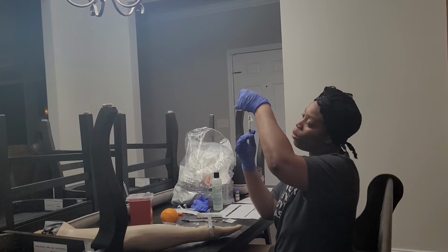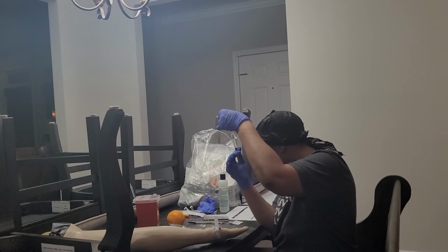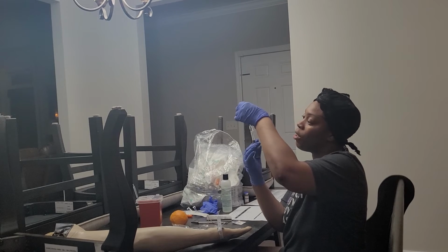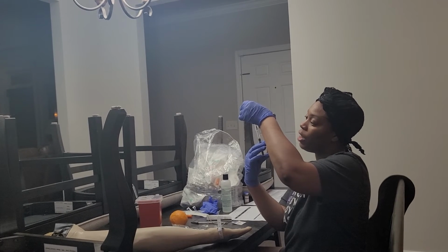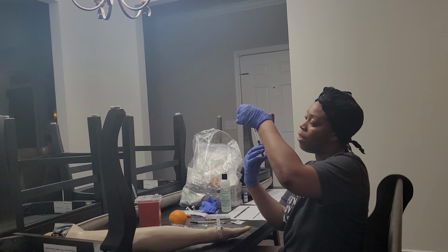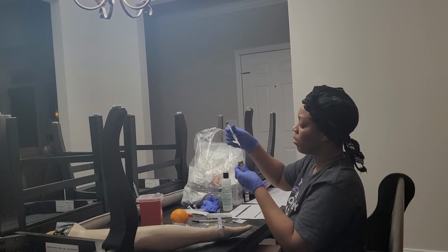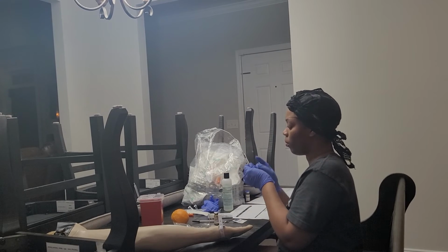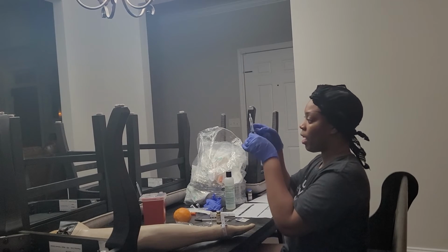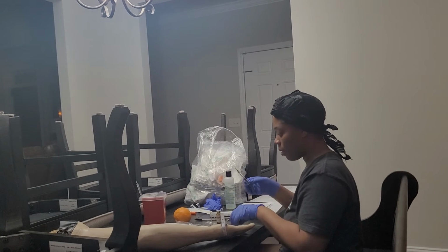And again, I'm doing 2 mLs because the order is for 20 milligrams IV push, and the medication is in 10 milligrams. So I had to do some dosage calculation where I came up with I need to administer 2 mLs to give the right dose. And there are no air bubbles. Just double checking, getting out any air bubbles, get it to 2 mLs.